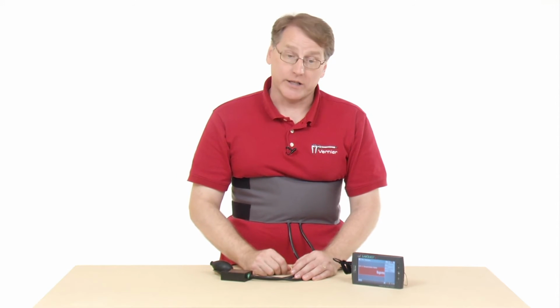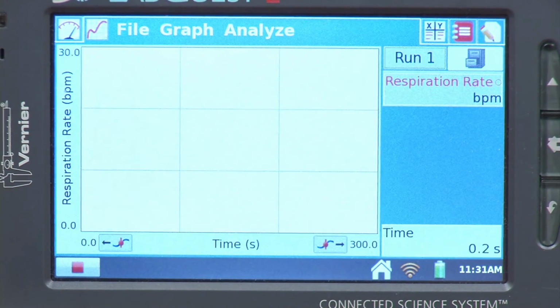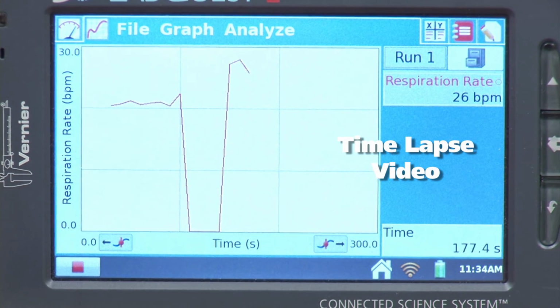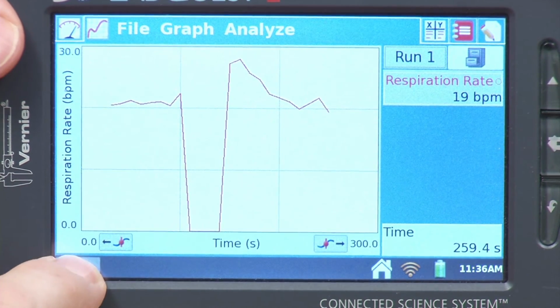That's fine. The experiment that I'm going to do, it's really simple. I'm just going to breathe normally for a period of time, then hold my breath basically as long as I can, and then start breathing again. And so I'll have kind of a flat normal respiration rate. It's going to drop down to 0, and then it's probably going to increase as my body tries to recover from holding my breath. So at this point, we're ready to collect. So I will press the collect button and start the process. And that's probably long enough, so I'll stop collection.